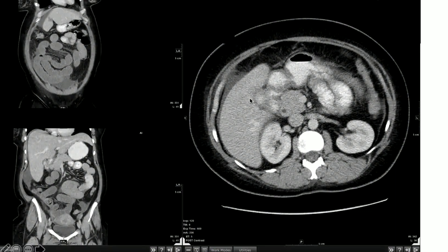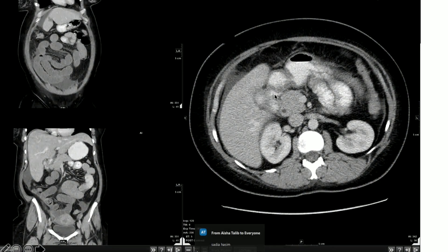On the CT, we can see there is stranding and contrast seen within the expected area of the gallbladder. If you look carefully, there is oral contrast and then a linear area of contrast tracking. This represents a fistula between the gallbladder and the first part of the duodenum.